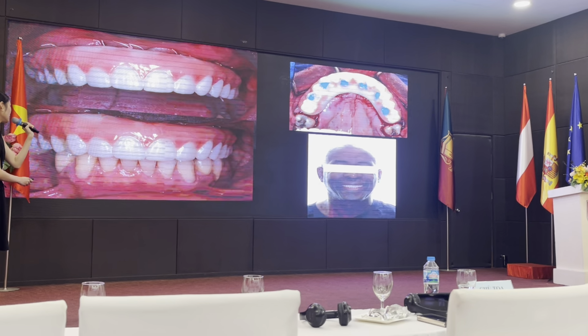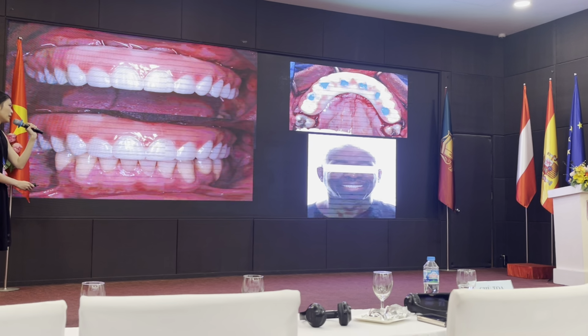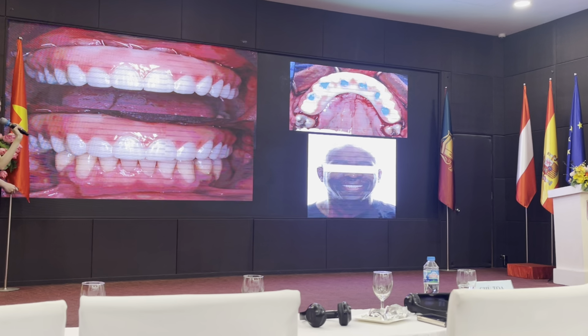And this 3D printing provisional was inserted to the patient's mouth again. And because there will be multiple screw holes from the temporary cylinder, so we try to fill that with the PVS, and that can be easily filled. And then this was the provisional prosthesis delivery.